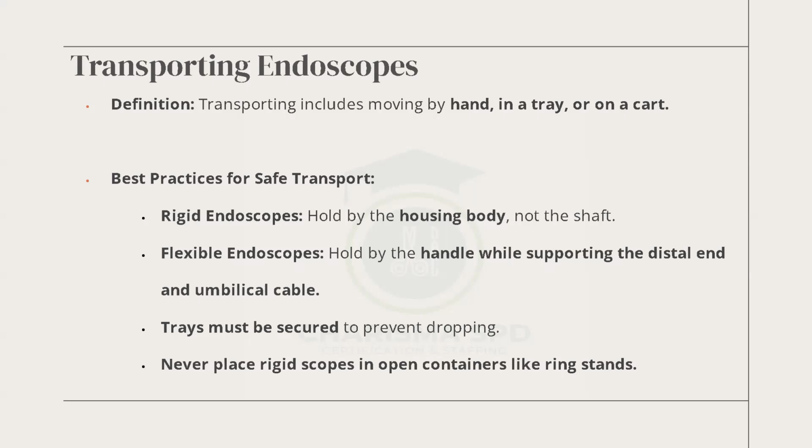If the scope has a case and the case has partitions, you have to make sure that you put it in the way it is meant to go and then transport it. Don't let it hang or be loose over there.